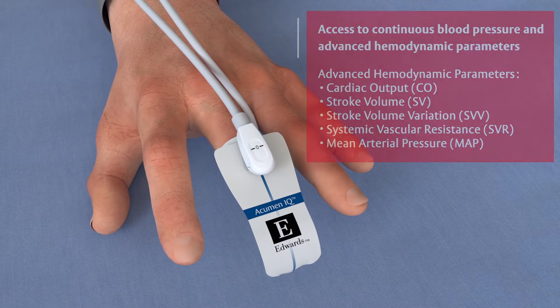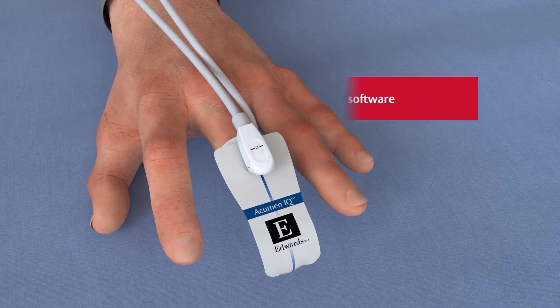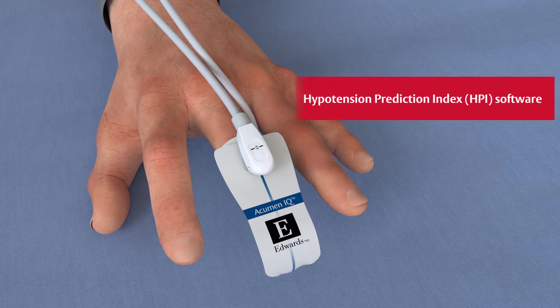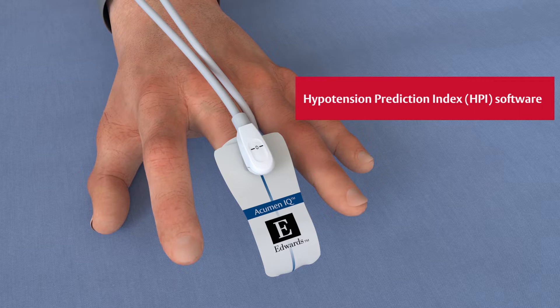Additionally, the AcumenIQ Finger Cuff unlocks the Acumen Hypotension Prediction Index software to enable clinicians to non-invasively detect and address potentially developing hypotensive events before they occur.